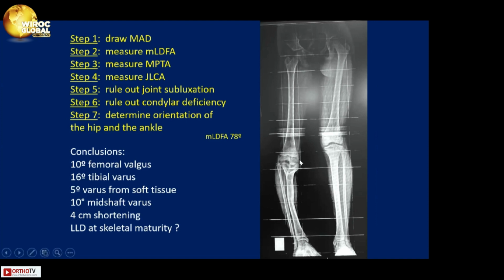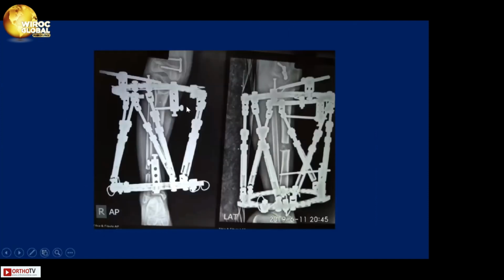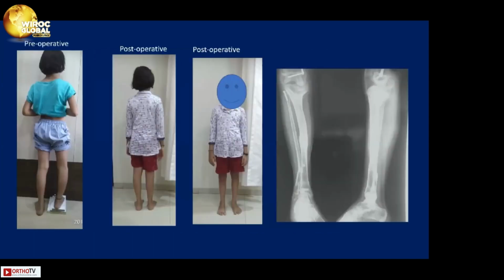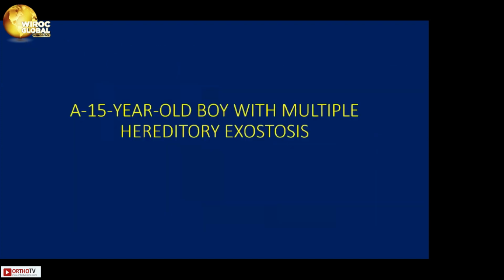For her distal femur valgus, an 8-plate was put in addition to the six-axis correction system to correct that valgus, and the varus deformity was corrected at the level of the deformity and lengthening was achieved. At the same time, physiodesis of the proximal fibula was also achieved. We are keeping her under close follow-up as she is going to need another lengthening at a later stage.